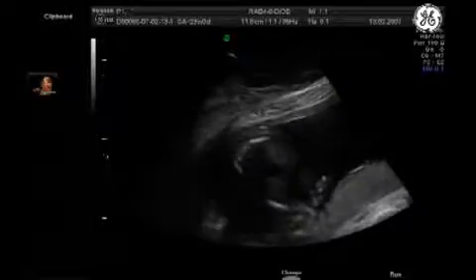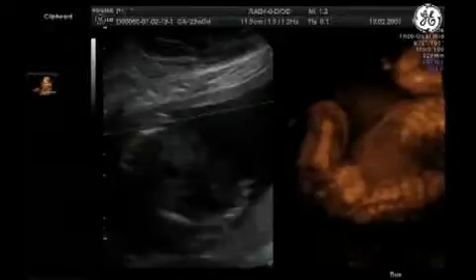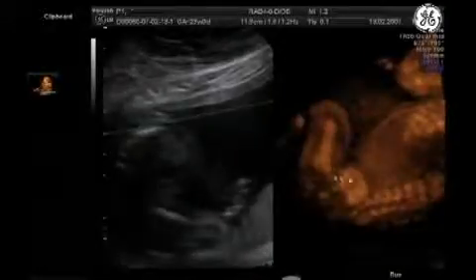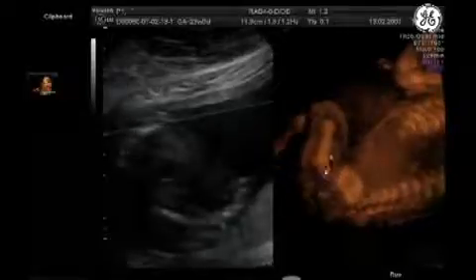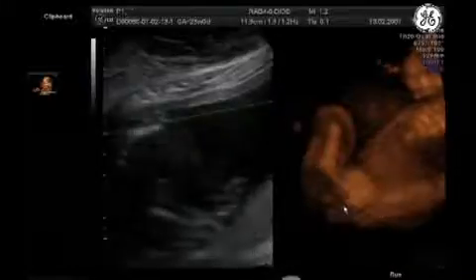One leg with the iliac bone. You want to have a nice view of the iliac bone, you only have to put the line here. And this is the iliac bone and the femur and the lower part of the spine.